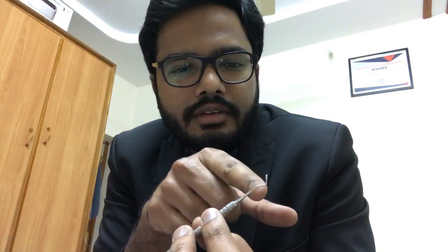What do you call this angulation? You have this angulation here, right? Have you heard of balancing? Balancing of an instrument. So we have these angulations, contra-angulations, so as to bring the working portion as close as possible to the long axis of the instrument, so that we can prevent any slipping of the instrument while we are applying pressure, right? I hope you heard of balancing.